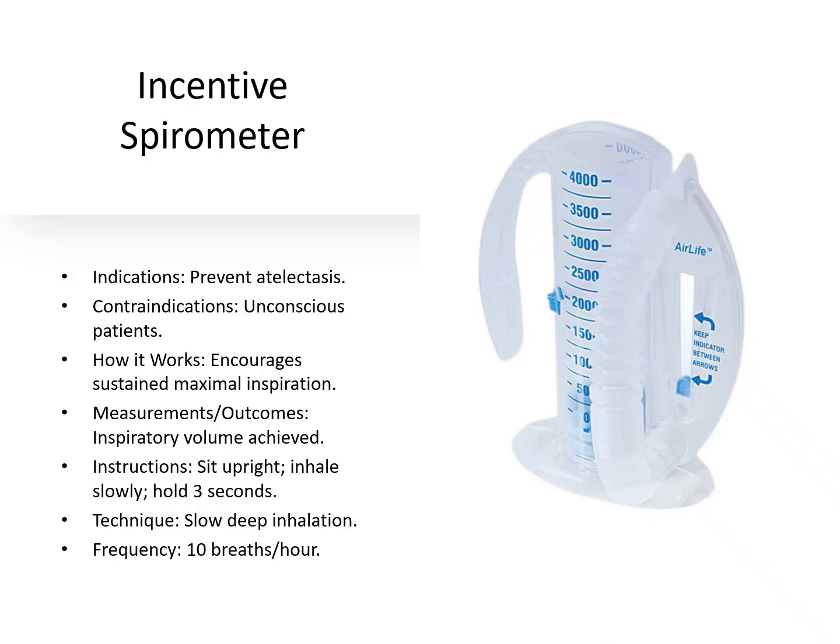Instructions include sitting upright, inhaling slowly, and holding for 3 seconds. Technique is slow, deep inspiration. Recommended frequency is 10 breaths every hour while awake.